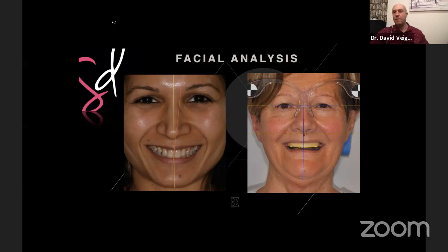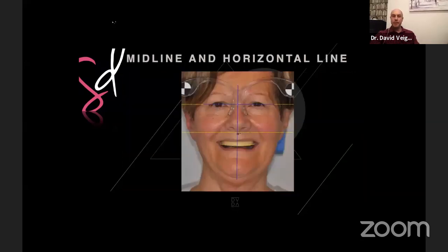That occlusal rim is a prescription, right? So I try to sculpt that occlusal rim as close to where I want that final tooth position as I can. And you know what, it might take me half an hour, 45 minutes to get that occlusal rim just right. But then when I get my setup back, it's going to be much closer to where the final tooth position is going to be.